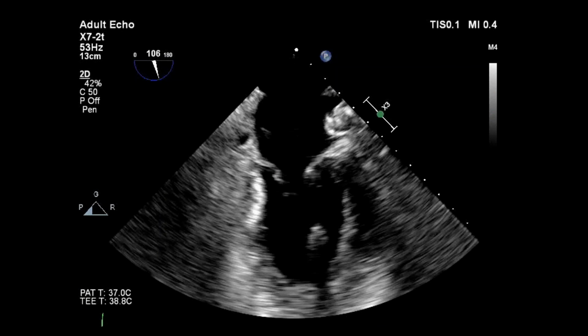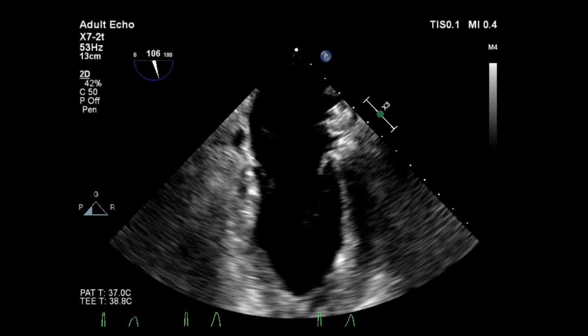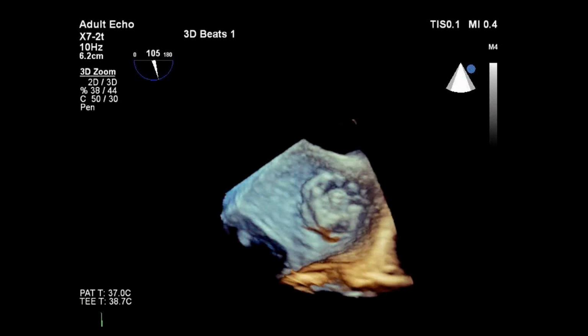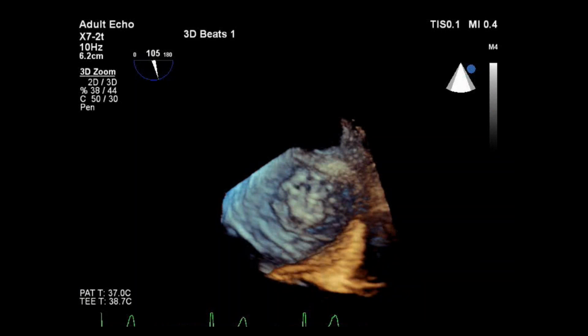This again is another picture, and you can see the mitral valve, the left ventricle, the appendage, and our occlusion device sitting here. This is a 3D TEE, and she gets great imaging views. This is the device well seated, looking at the appendage. It's like one of those anatomical shots. We're looking at the face of the device sitting in the appendage.